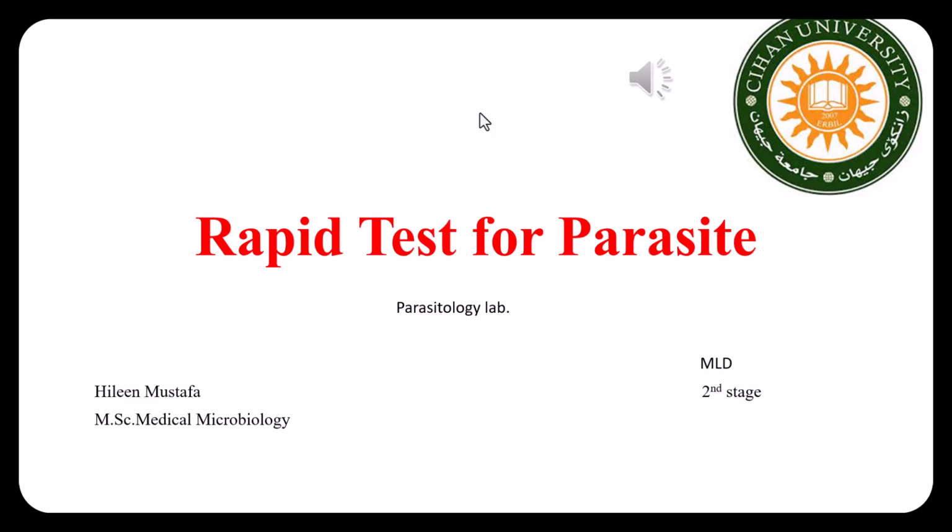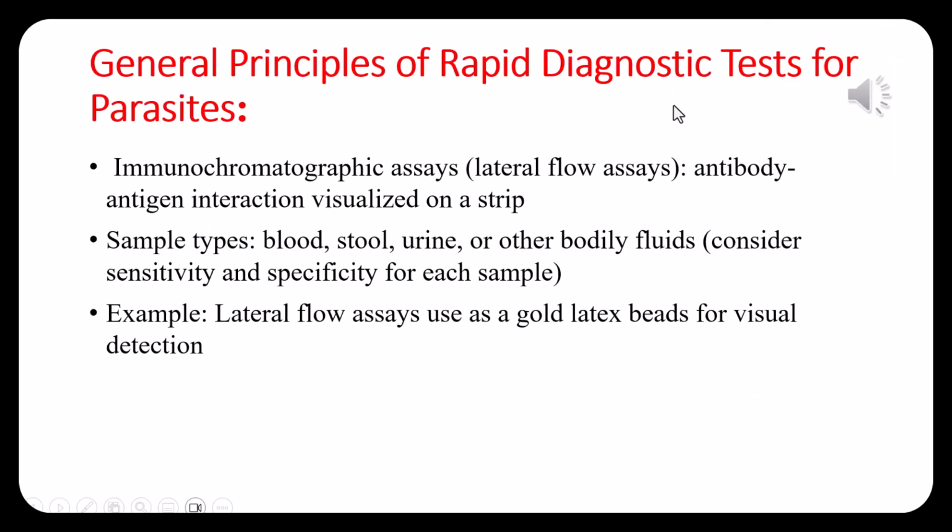Most of you know what a rapid test is and how we do this test. But today we are talking about the rapid test for parasitology: do we use it or not, and how can it help us in the diagnosis and detection of diseases caused by parasites? The general principle of the rapid diagnostic test for parasites.